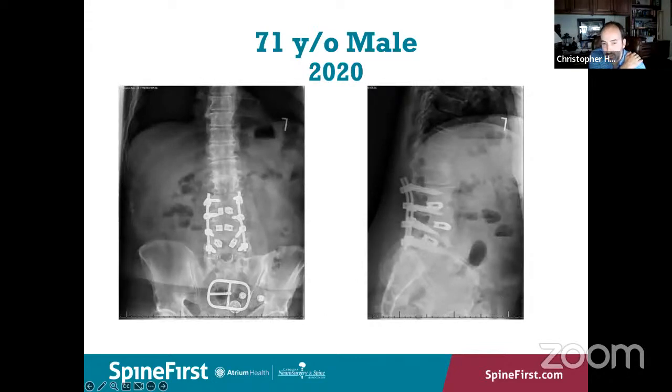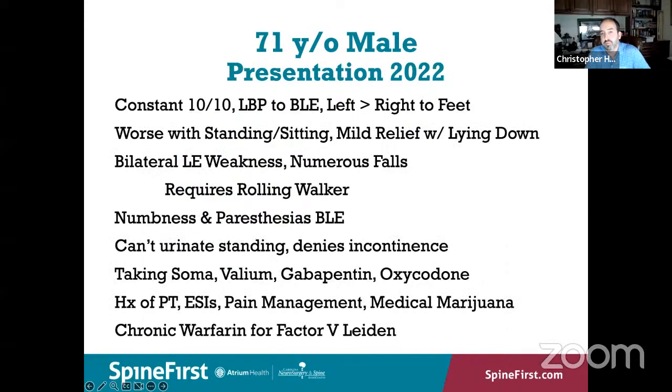So this is what this looked like in 2020. The patient had bilateral titanium cages at the proximal segments, bilateral PEEK cages at L5-S1, with an extension fusion construct from L2 to L5. At this point, he's having chronic pain, his surgeon has left the state, and he's looking for additional care. So he gets several surgical evaluations. He's being referred to chronic pain management. People are discussing spinal cord stimulation with him. You can see what still looks like solid bone fusion at L5-S1, likely still pseudoarthrosis at L4-5, and possible pseudoarthrosis at the proximal segments. So this is when he presents to our office in 2022.